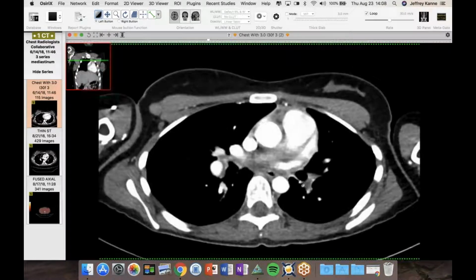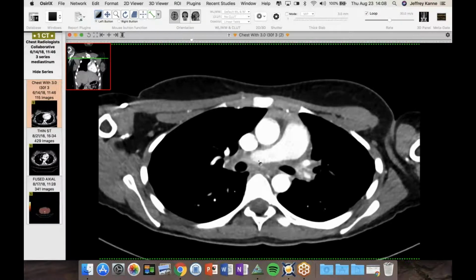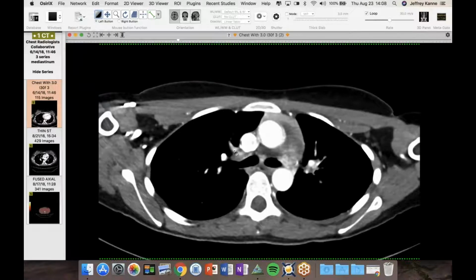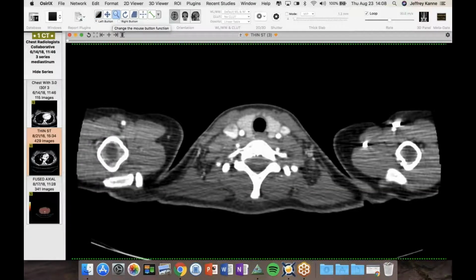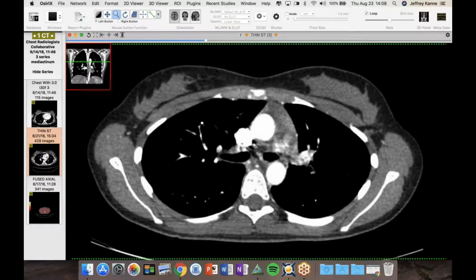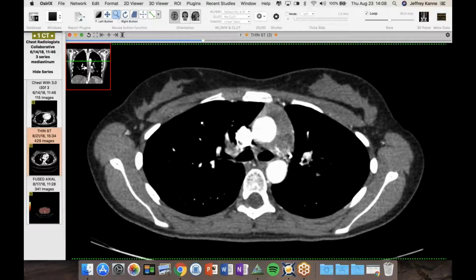And you can see it's just very thread-like. But there's a lot of soft tissue in the mediastinum. And then the other area that's abnormal is her right upper lobe pulmonary artery. So here's the right main coming up, and it's just this thread of contrast going through here and just a little nubbin of the superior segment. Let's see, I've got a newer scan with some thinner cuts. In her older scans, she had progressive narrowing of that left side, and the right side involvement is newer. She's had a VATS biopsy, a mediastinoscopy, and a bronch biopsy, none of which have shown granulomas or malignancy, and they even did IgG4 stains, and none of that was positive.